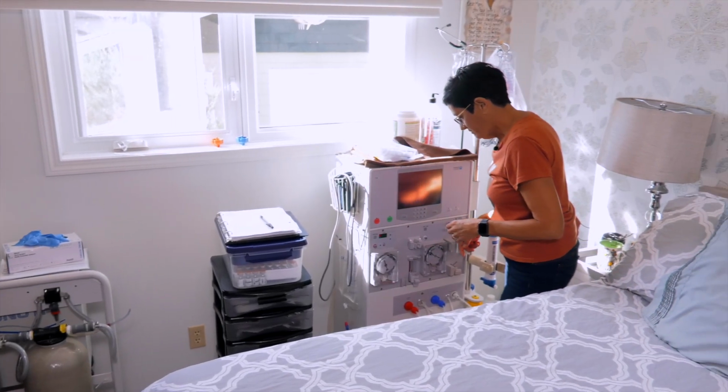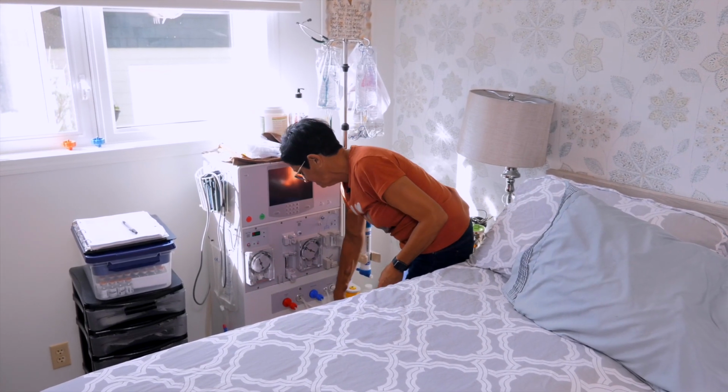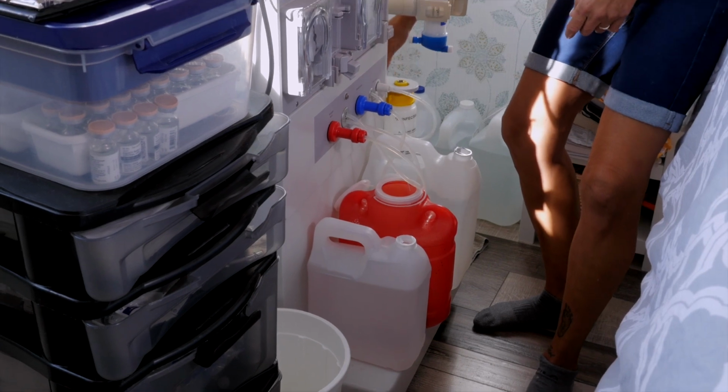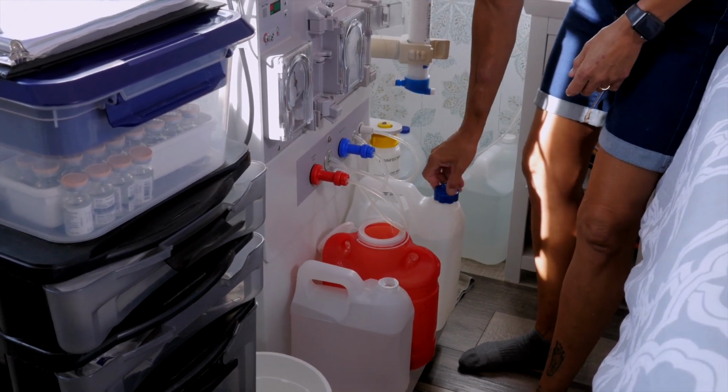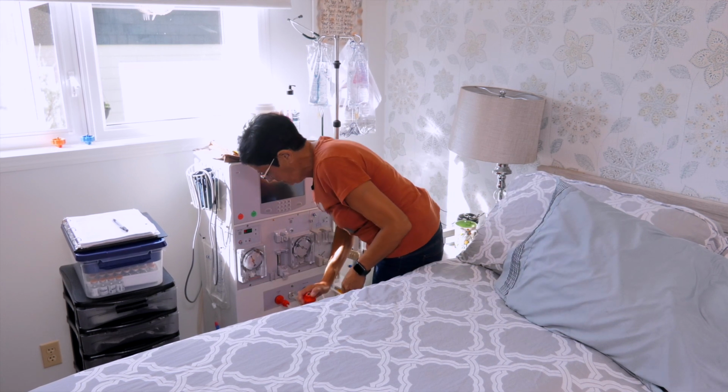Then I come over to my machine. There's my acid concentrate, my bicarb concentrate, which is prescribed to you by your doctor, depending on what you need. It'll clean your blood.